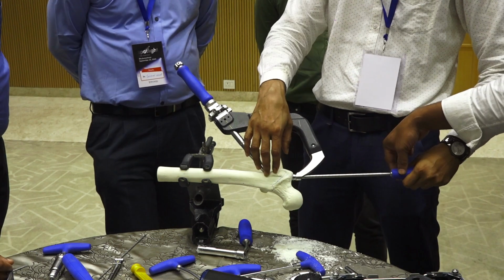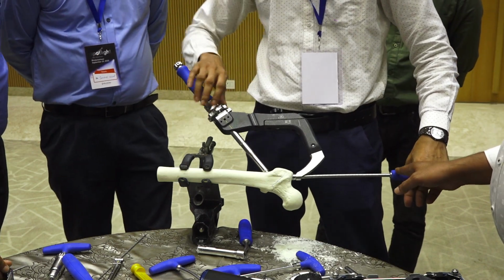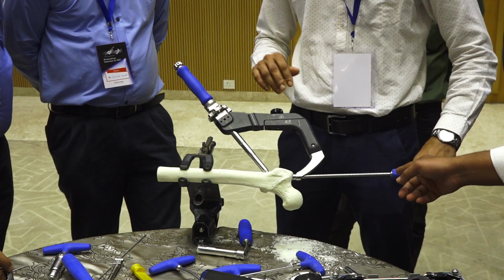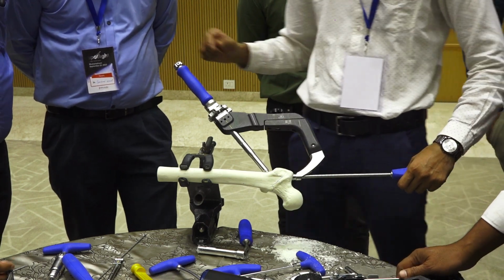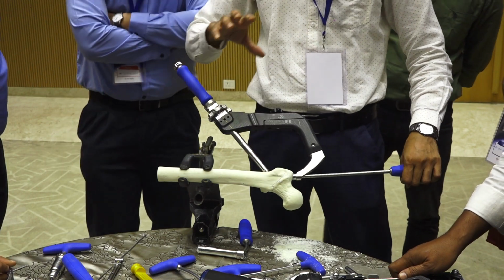After that you can give compression by releasing the traction and rotating it one complete turn, so that the screw will get backwards. After that you release traction and then you can give intraoperative compression.